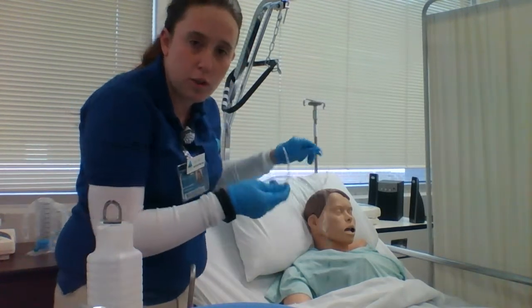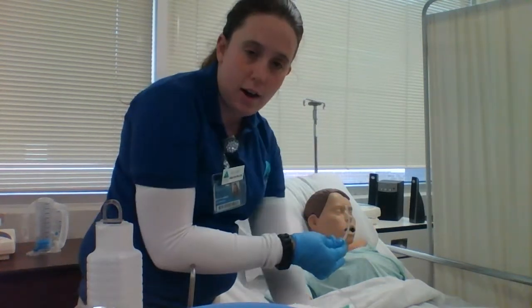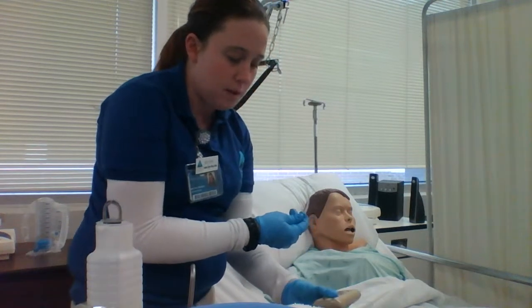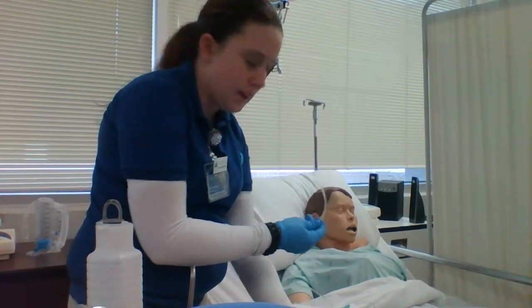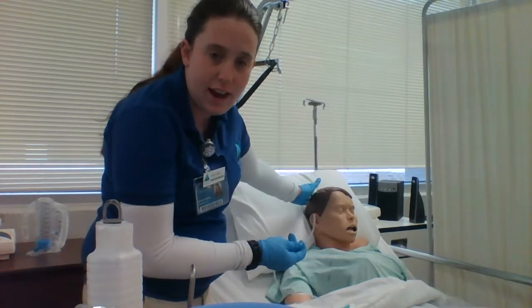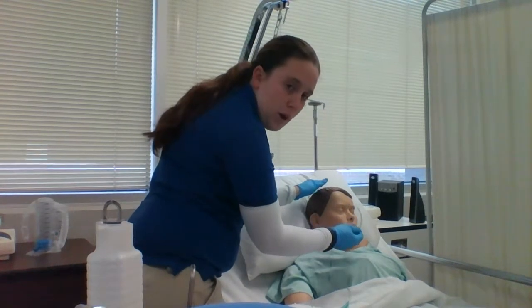And now I'm just going to let the patient know that we're going to go ahead and begin the process. The position of the bed needs to be in high Fowler's, okay, which it is, and have the patient have his head extended back on the pillow, and let him know what I'm going to do.